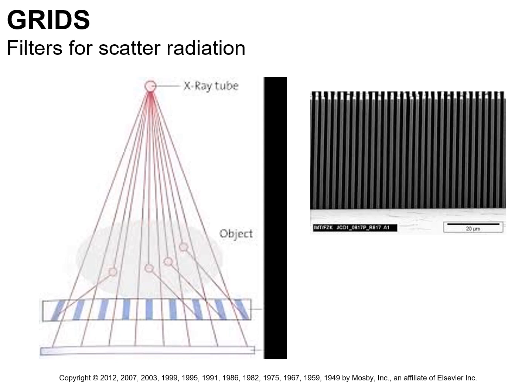Now, grids. I mentioned grids briefly. When a body part gets too thick, we generate scatter radiation. The scatter radiation heads off in random directions. We can't predict those directions, and it actually detracts from useful information on our image receptor. And so we put in this grid that is essentially a filter for radiation that deviates from the geometric norm. So you can see all the primary X-rays are basically traveling in an expanding triangle. Right? See how it's all symmetric, expanding red lines?